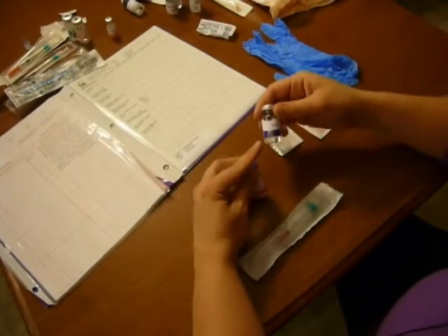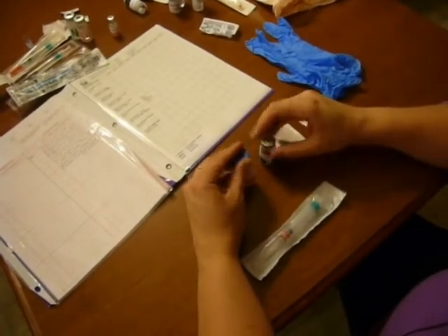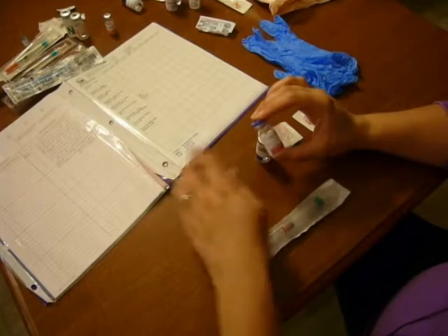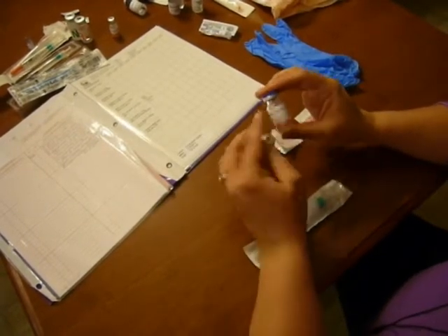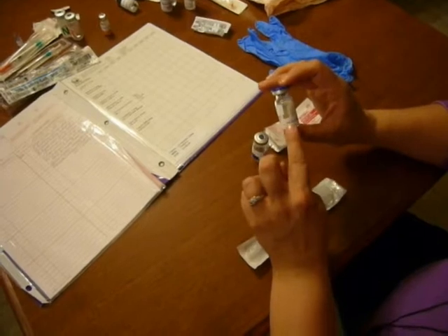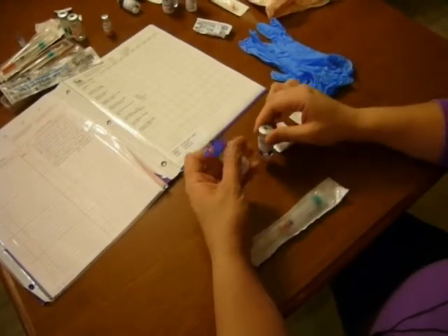We're going to mix powder with diluent so that we mix a powder med into a solution that we can inject into our patient. The med we're going to do that with is called Solumedrol. The order we have is for Solumedrol 125 mg intramuscular stat. This vial has 500 mg, and on the back it will tell you that we need to add two cc's of diluent, which is just a fancy word for something that dilutes out the solute.